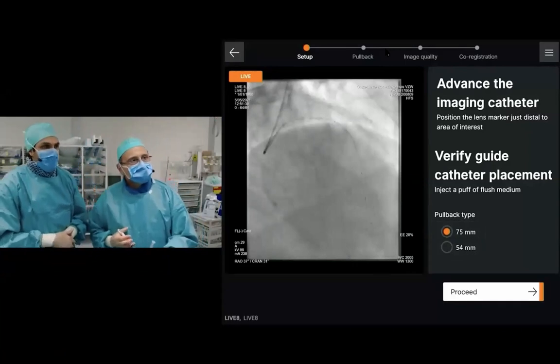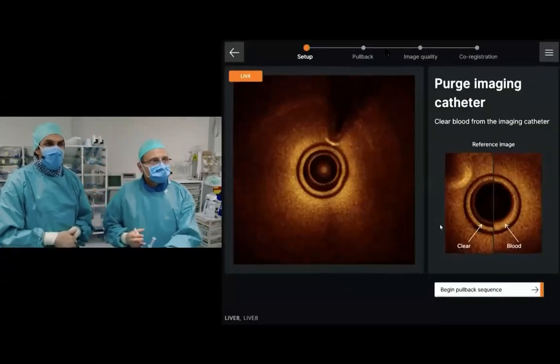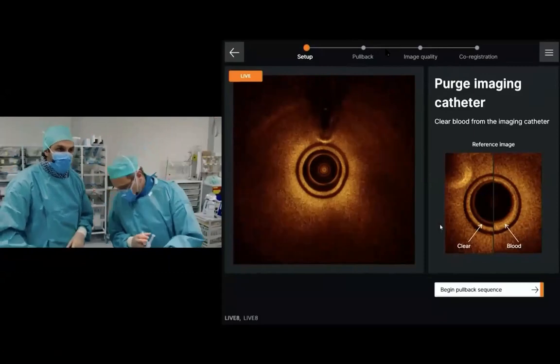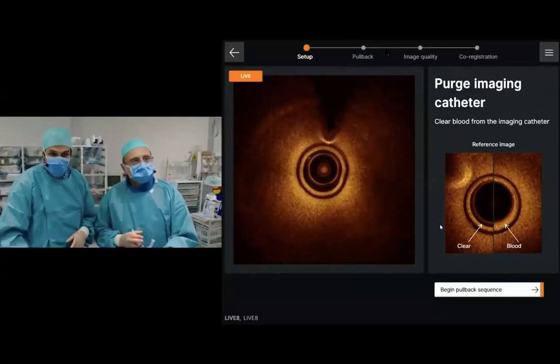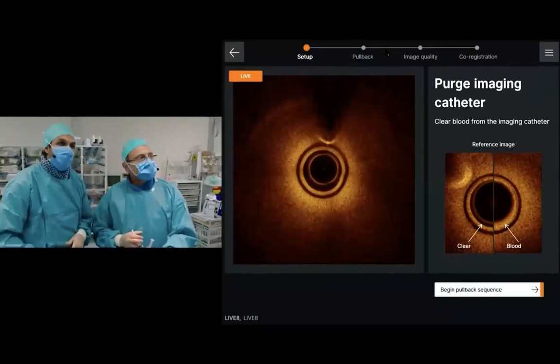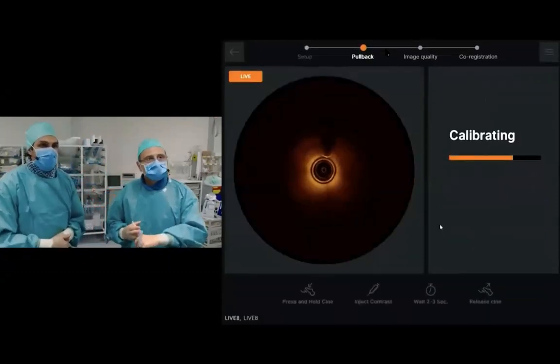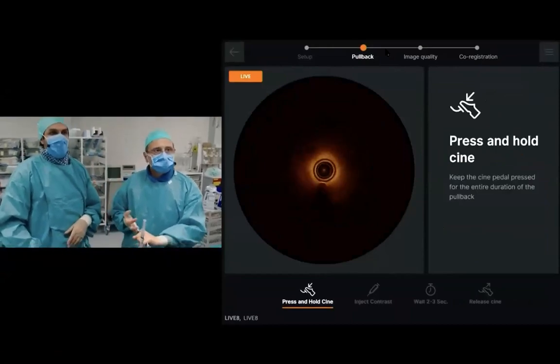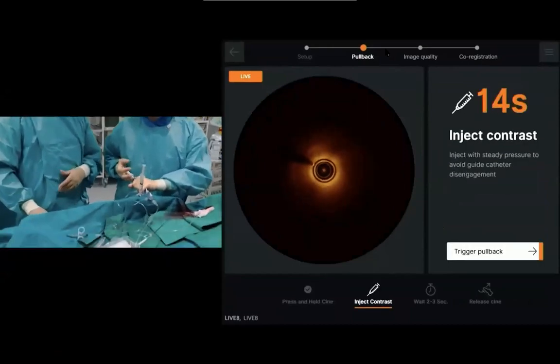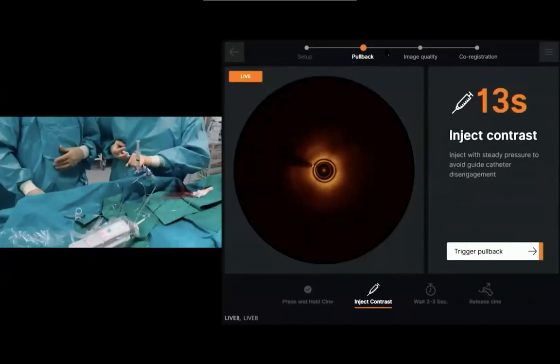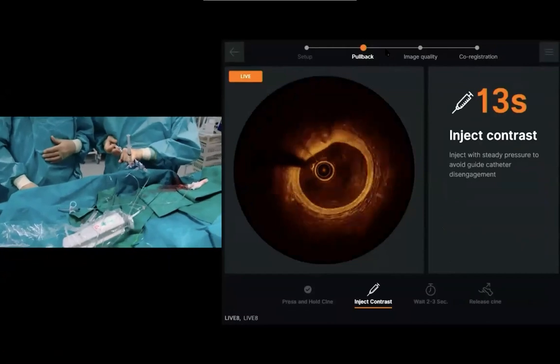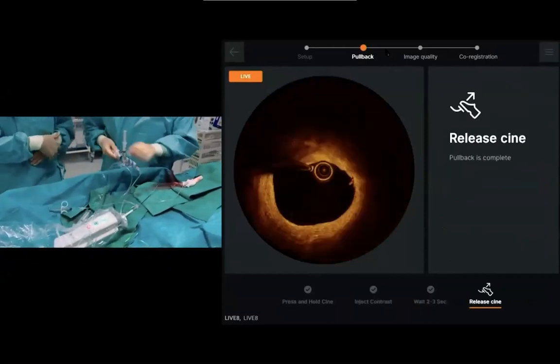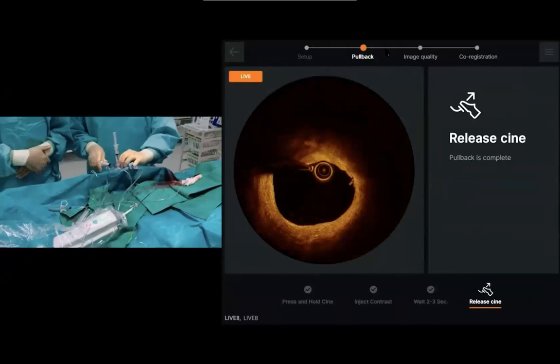I'm going to click proceed. Then the software will ask us if we are happy with the amount of contrast in the vessel or blood. We're happy with this, so we're ready to go, Emanuele. We're calibrating, and you can start. I'm going to trigger the pullback manually. That is a beautiful opacification, Emanuele. I think we have a very high quality pullback and we're going to be able to make a very nice analysis of the plaque.